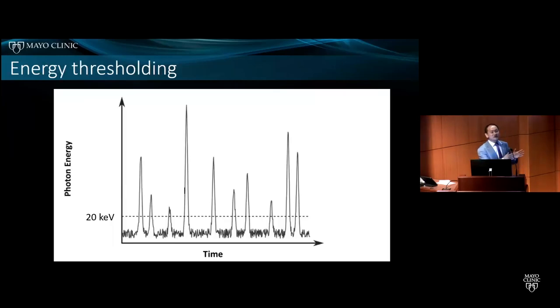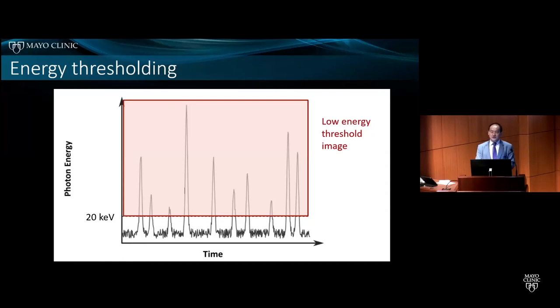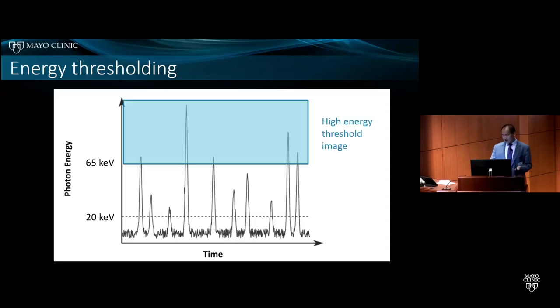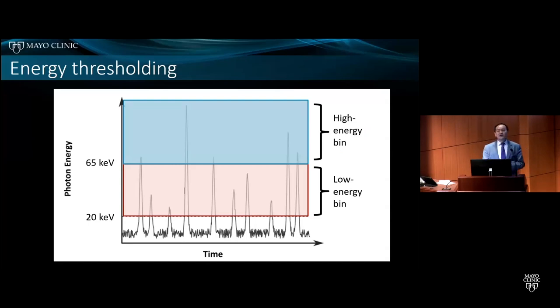Imagine we have a train of radiation events with a lot of photons coming in. The detector allows the user to select the energy threshold. Let's say we pick 20 keV so that we can exclude a lot of the noise below. Those are noise, not signal, but we leave all the signals there that we can detect. We count how many photons are above this threshold, which gives us one set of data. Then we can use a different threshold simultaneously that gives us a count of the photons over that energy, essentially giving us another data set. We can also count how many photons are in between. So intrinsically, with photon counting, we count individual photons and put them into multiple bins according to energy, which intrinsically gives us multi-energy information. That's how the photon counting detector works.